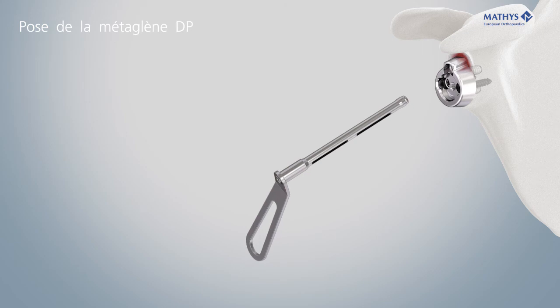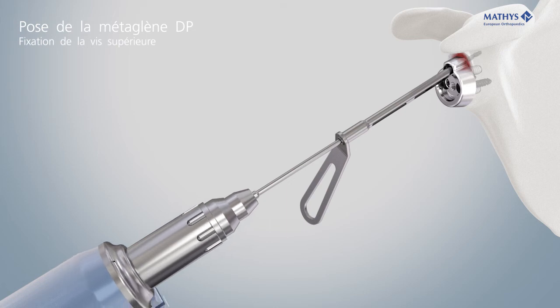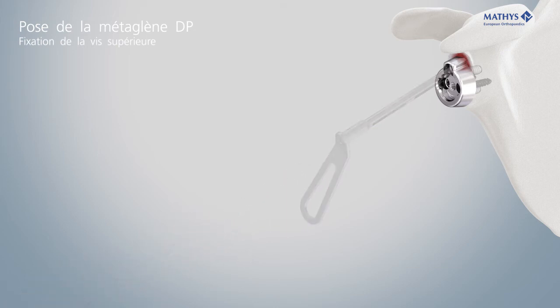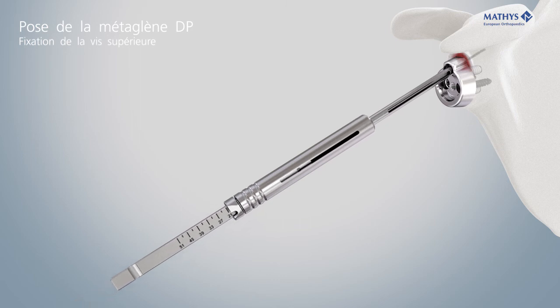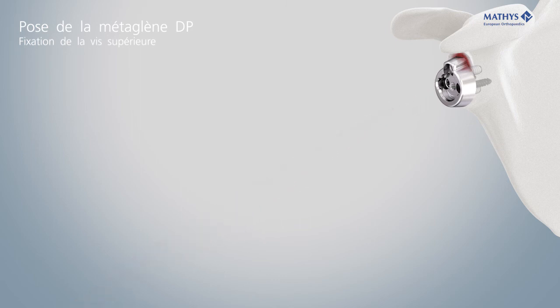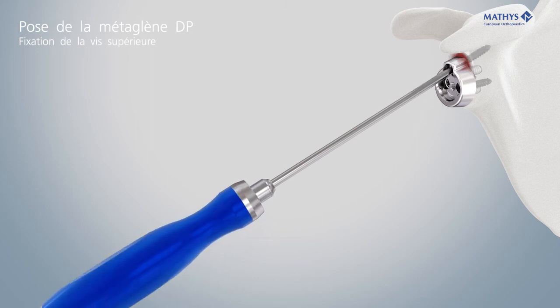Analogous insertion of the superior screw. The superior screw can be oriented with an angular freedom of ±10 degrees to the neutral axis of 20 degrees. The superior screw must be locked with the cap in order to lock the desired screw angle.